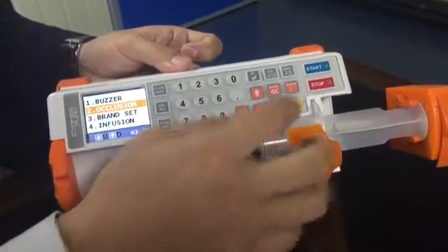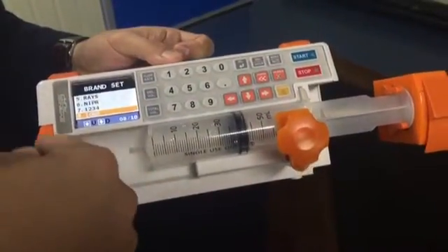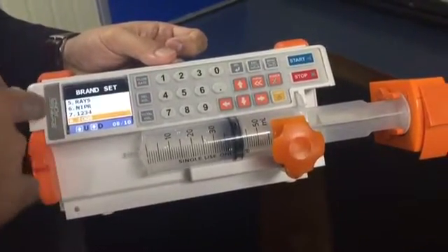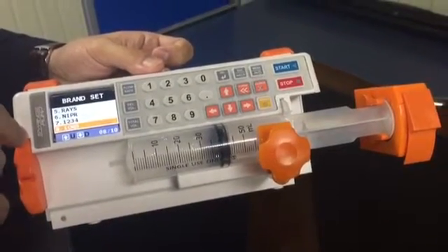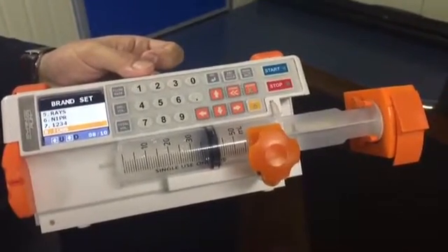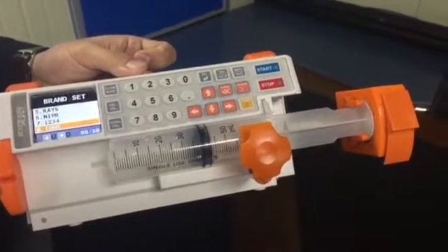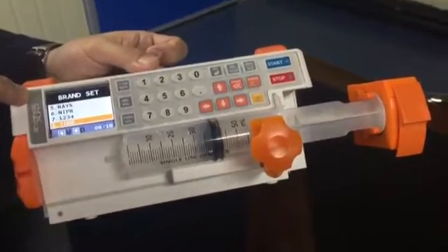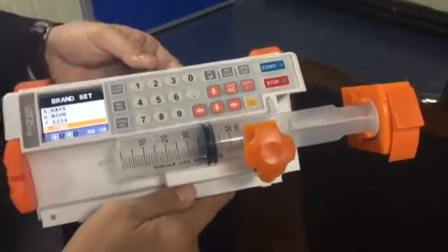In the brand set, there are some brands already set up in this unit. But if you want to use another brand, you should ask the agency or manufacturer, specifying the brand you want to use. The manufacturer or agency will calibrate the machine before they supply it, so this is a very important setting.